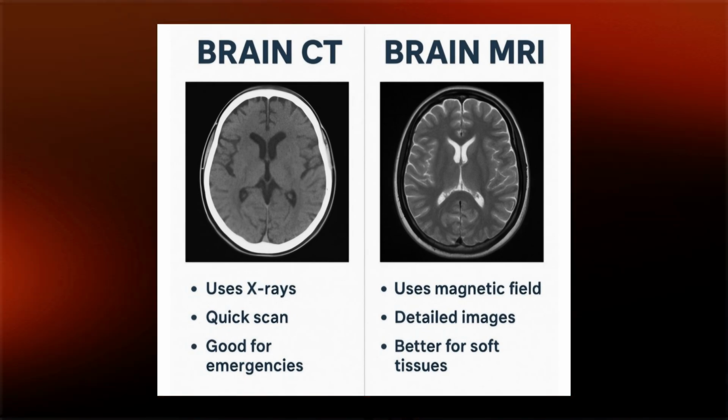And like I already said, the CT scan is good in lungs, in angios, and in bones. Now, I'll quickly go through systematically to show you the strengths, for those of you who are listening in and are medical doctors, who may be interested in knowing when I refer which patient for what examination. You as a patient may say, my doctor referred me for this examination, and you understand why.